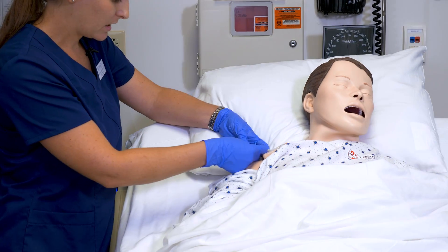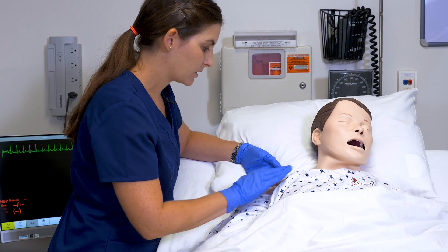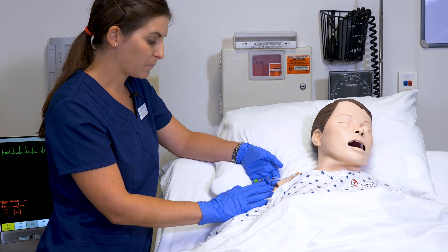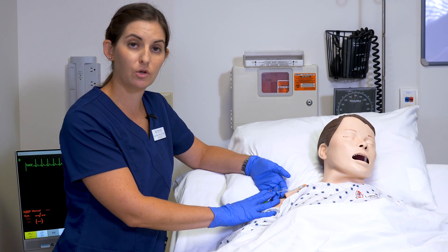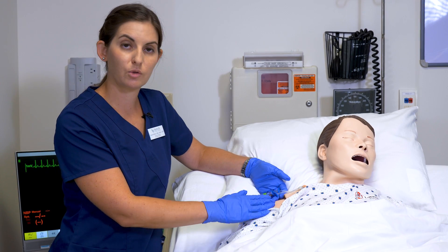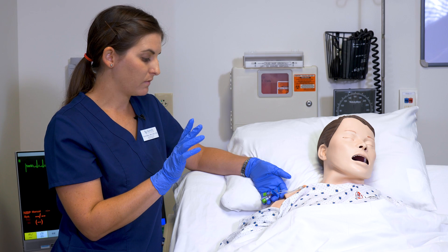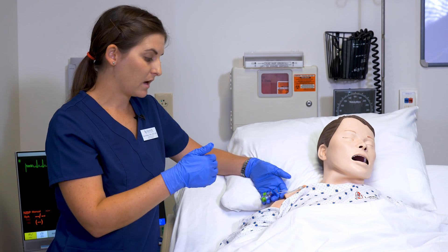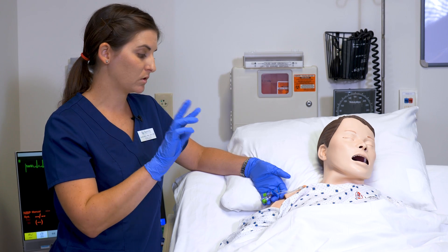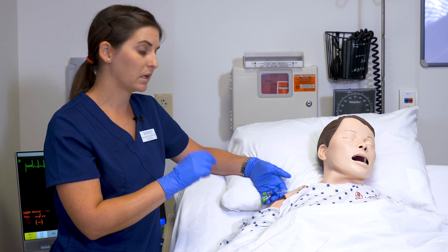I'm going to check the site to make sure everything looks good. I don't see any redness or drainage around the site. I'm also going to pick which lumen to use. This patient has a triple lumen. When you have a triple lumen you typically have three ports — the three are separate lumens that never mix, so you can put three different incompatible medications into each line.